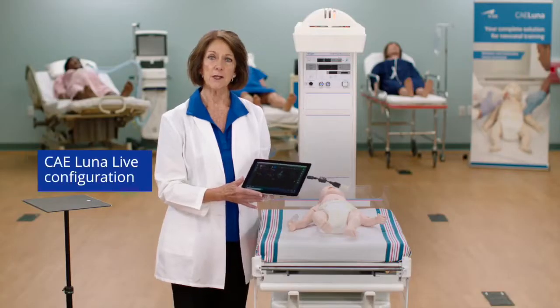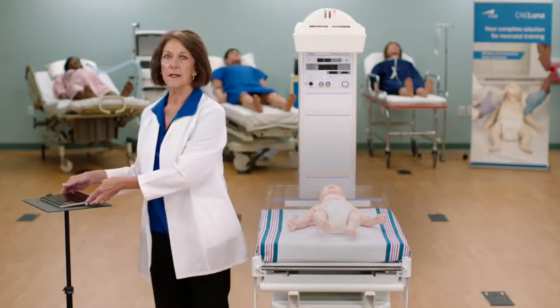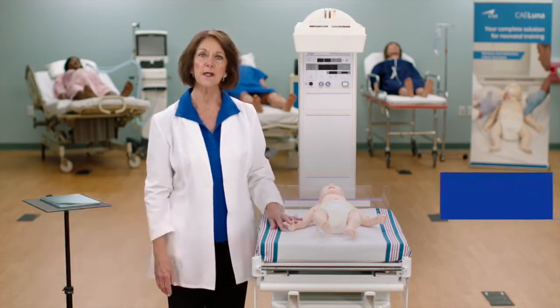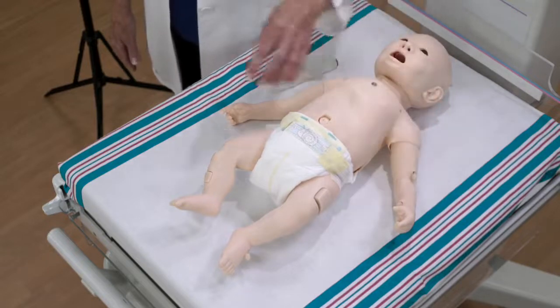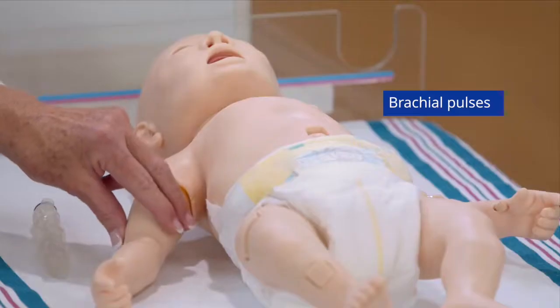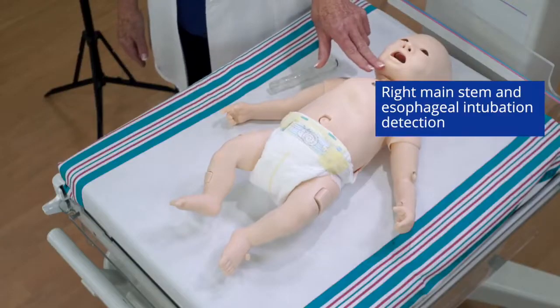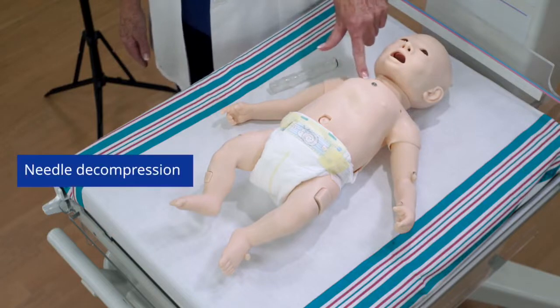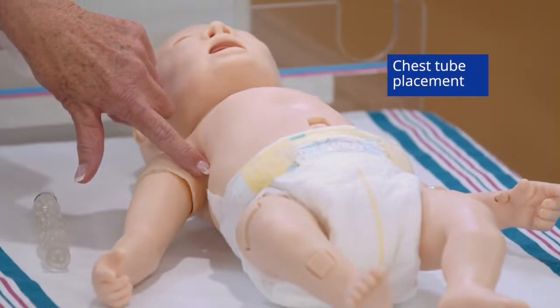The Luna Live configuration supports all features within the base model, plus CPR performance metrics, 3-lead ECG display on a commercial ECG device, brachial pulses, and right main stem and esophageal intubation detection.